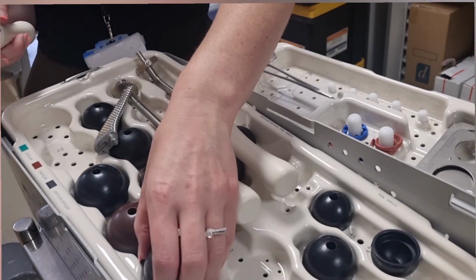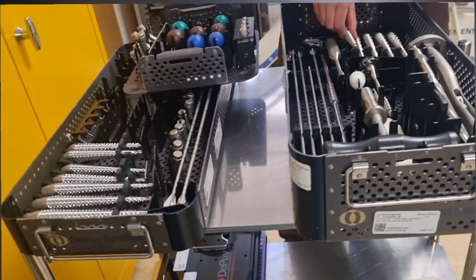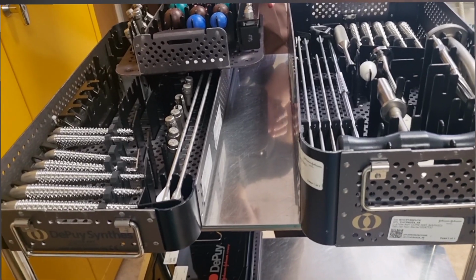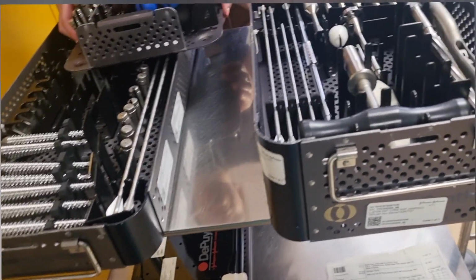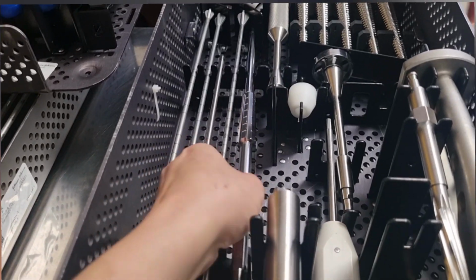Anyway, we can start with the system. You've obviously seen this before. Yeah, I've used it twice. Oh, you know what? I don't know what it's for. It's this one. Normally it's called a lateralizer.